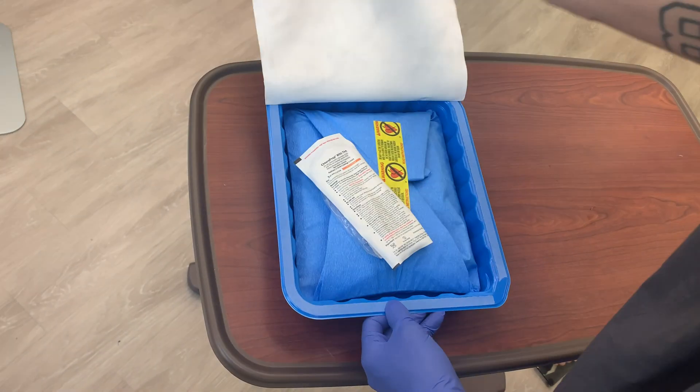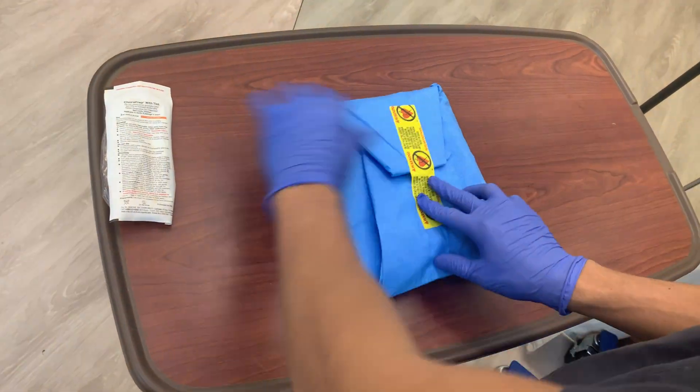Next, open the central line kit using sterile technique. Begin by opening the kit away from yourself.